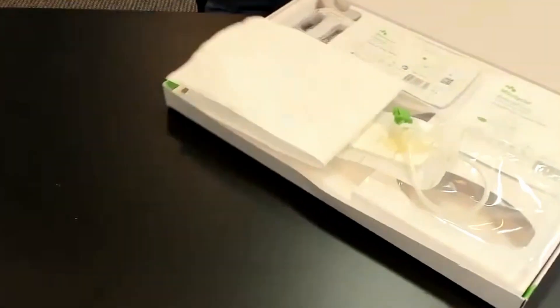Hi QSAP team, it's Marianne Opes here, your wound nurse. I thought I would put together a couple of very short videos that could help you out if you can't remember one of the little steps on how to place different wounds. Today we're going to do the incisional wound vac by the Molnlycke company — it's called Avance Solo. I put the dressing on my husband, who is a wonderful volunteer showing you the steps on how to put it together, how to place it onto a human, and a couple of troubleshooting things.